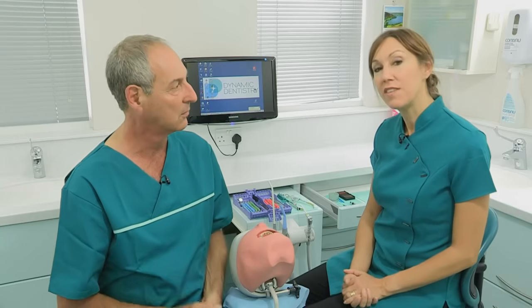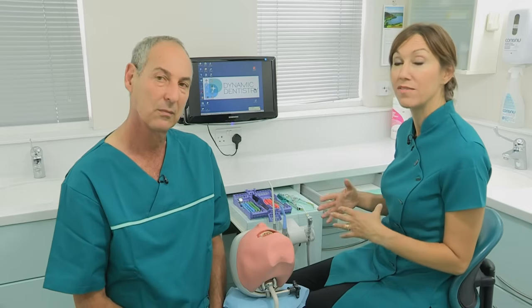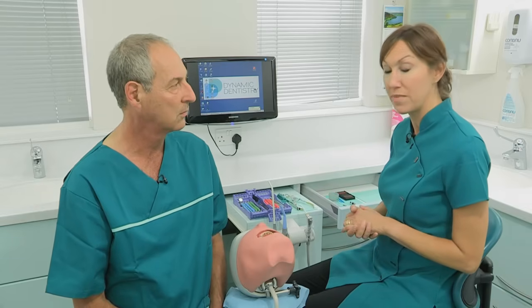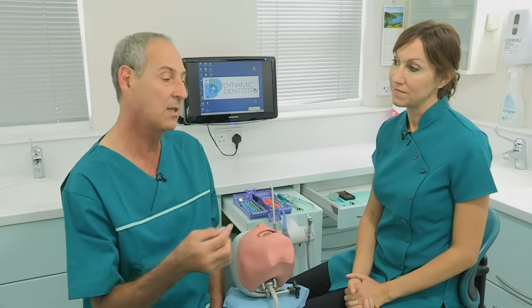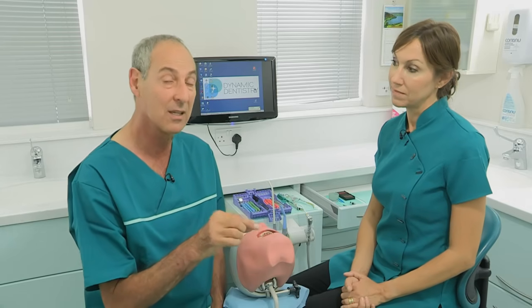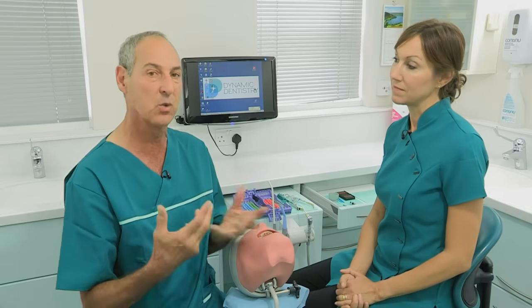Well, I think the added benefit you get, along with the cross-infection control, which makes it a lot easier for the nurse if she's got control of the instruments her side, is that it's just a lot more interesting for the nurse. She can see what's going on in the mouth and feels part of the team. And in fact, Sally often says, because she's sitting in a different position to me, eyeline-wise, she'll say, have a look at the distal of this bit of tooth. I think there's something there that you might need to look at. And it's great to have that teamwork between us.